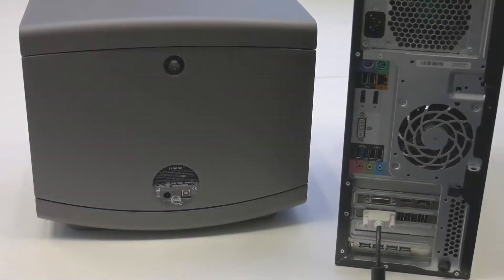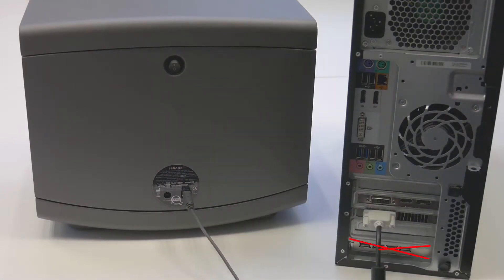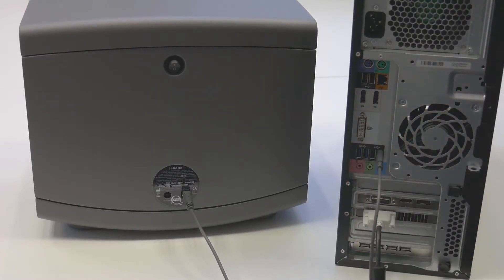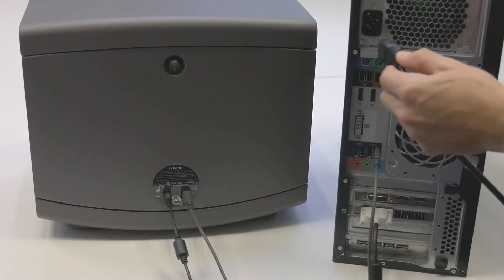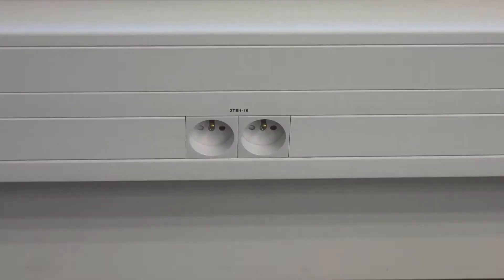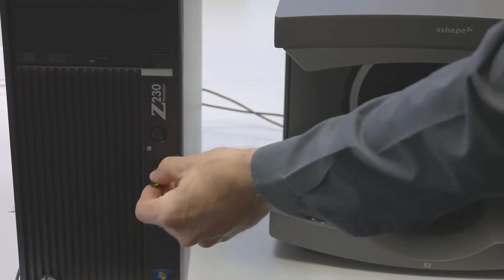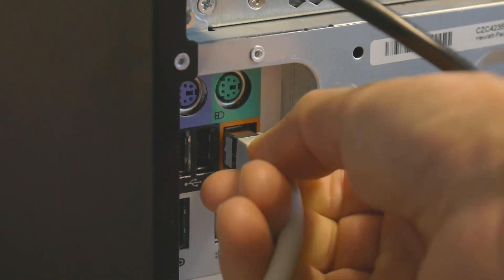To connect the e-scanner, use the two supplied cables. First, connect the scanner and the PC using the grey USB cable. If the PC supplied with the e-scanner has a USB hub, do not plug the scanner there — please use one of the upper USB sockets. Then plug the scanner and the PC to grounded power outlets using the supplied power cables and power supply. Plug the supplied T-shaped dongle to the front USB port. Before you turn your PC on, make sure it is connected to the internet.